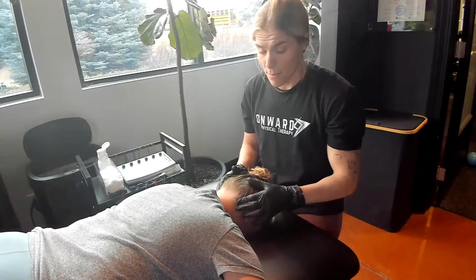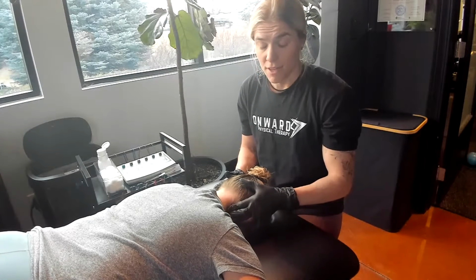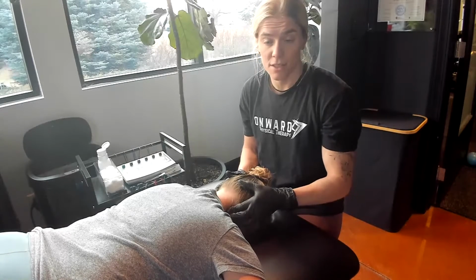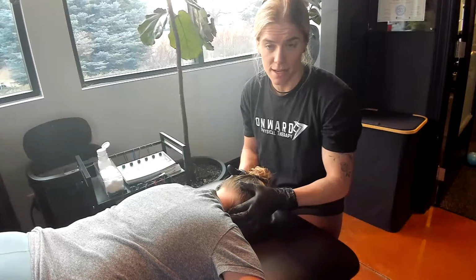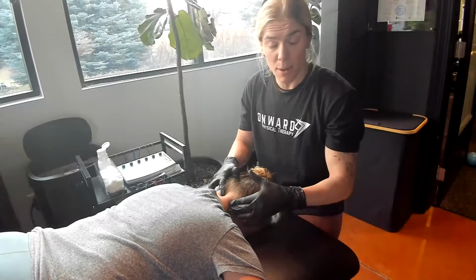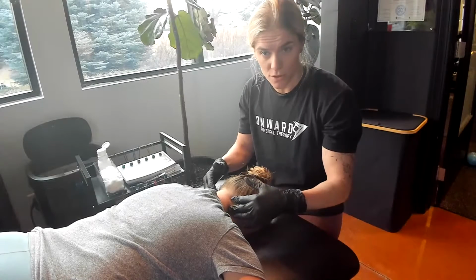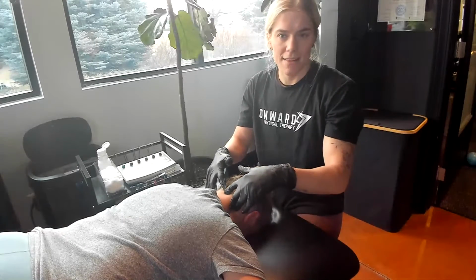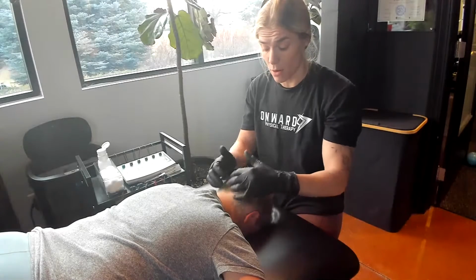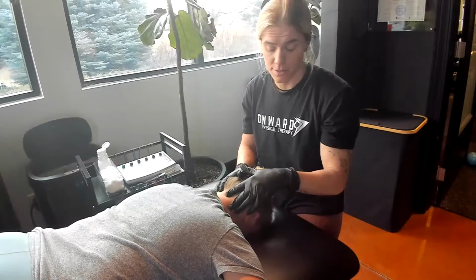Let's come back towards the mastoid process. From there, if we drop just distal, feeling the lateral pillars of the neck, the first thing we palpate there is the transverse process of C1. So the true suboccipitals live between the spinous process of C2, the transverse process of C1, and that inferior nuchal line. So we do not want to be needling in that area today, as it's a little bit more of an advanced technique. And I think when we're talking about the headaches that present at the base of the occiput, it's actually not the true suboccipitals.